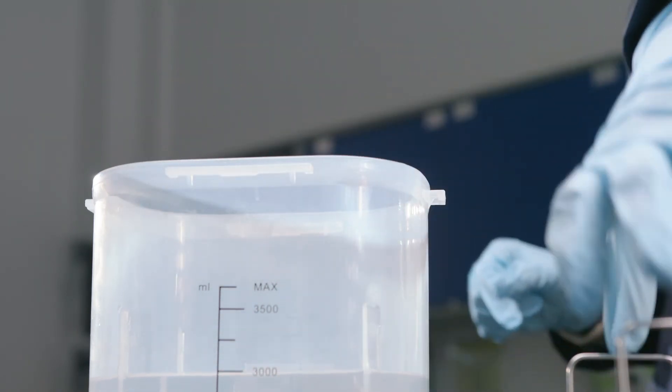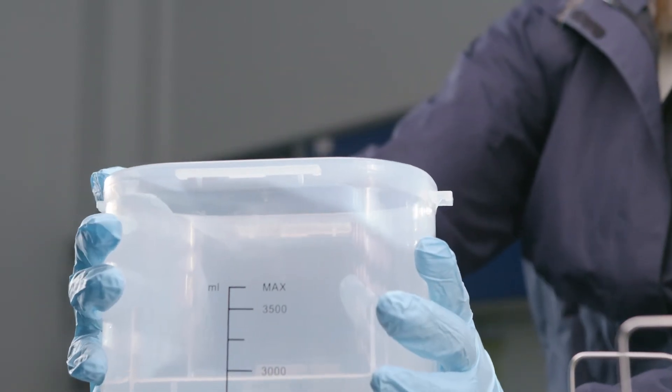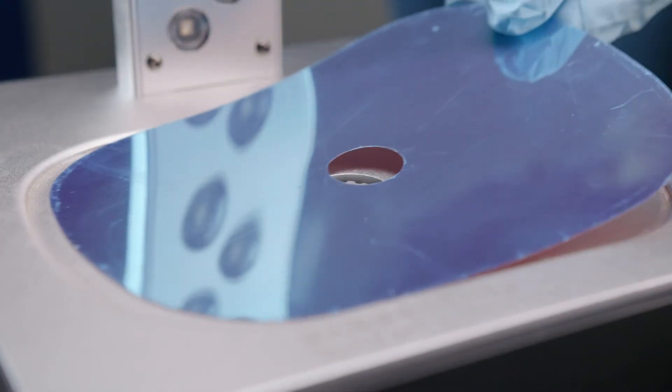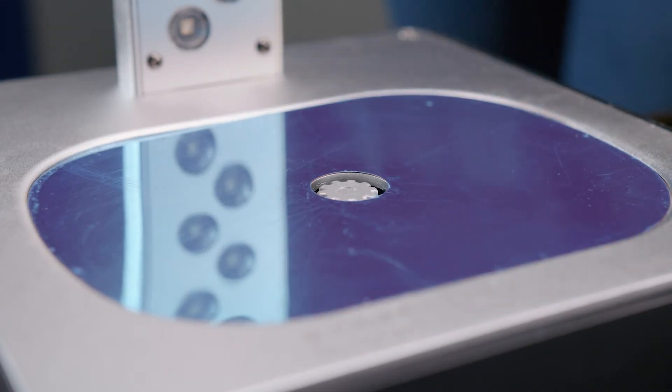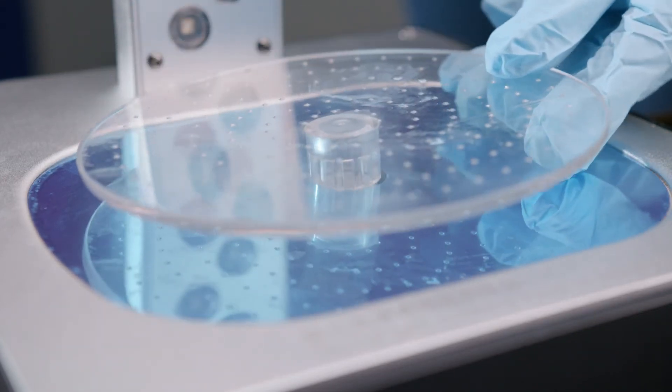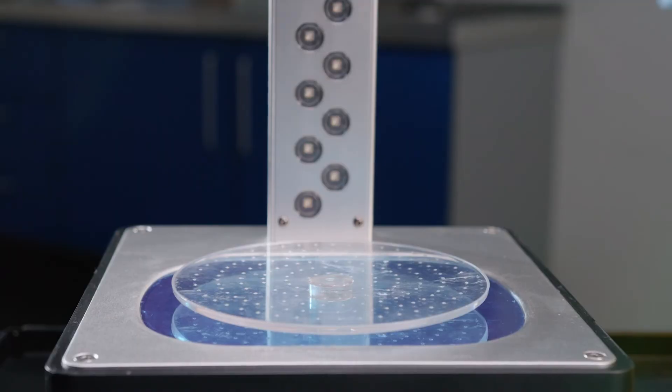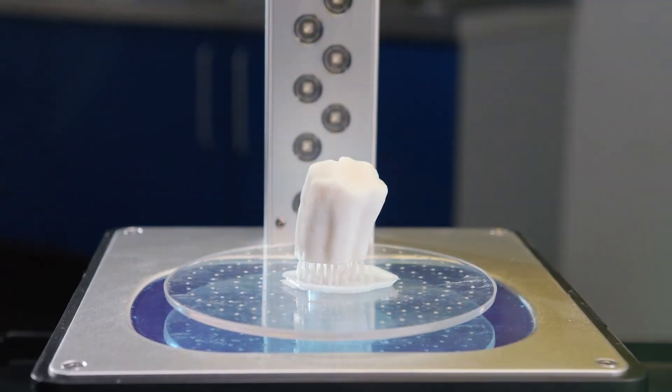The post-processing station is converted for curing. To do this, place the mirror foil on the floor and insert the corresponding rotating disc. The tooth must be placed on this disc. The station must be closed with the lid.